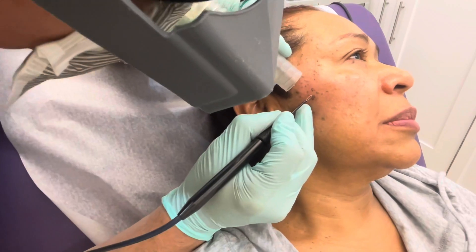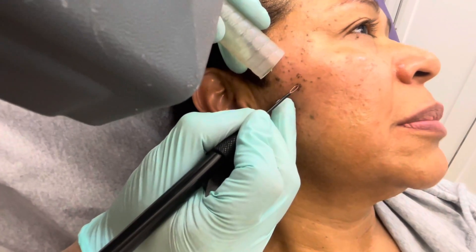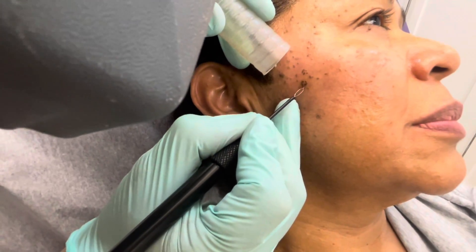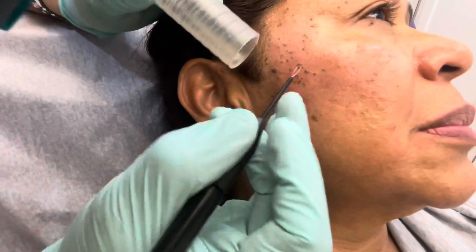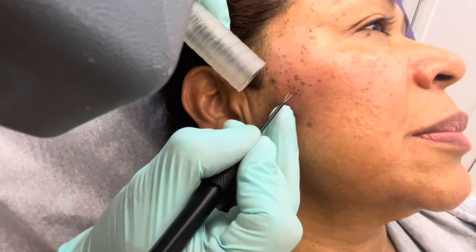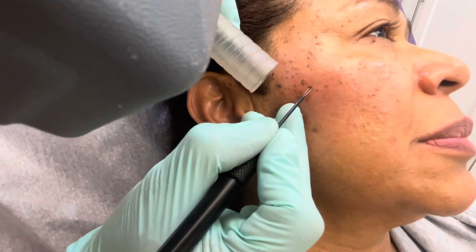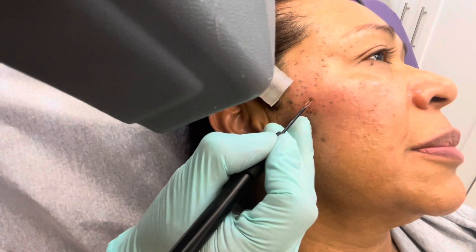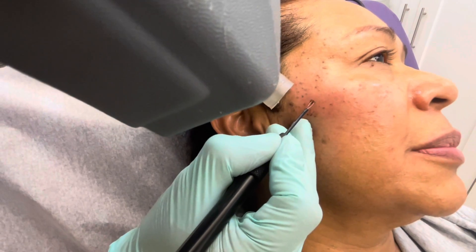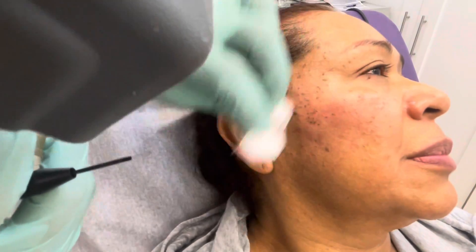You can see how we get close up so you can see very nicely. It's a very delicate work because it shows a lot of those. We only work on the epidermis layer, so it shouldn't leave any scars.